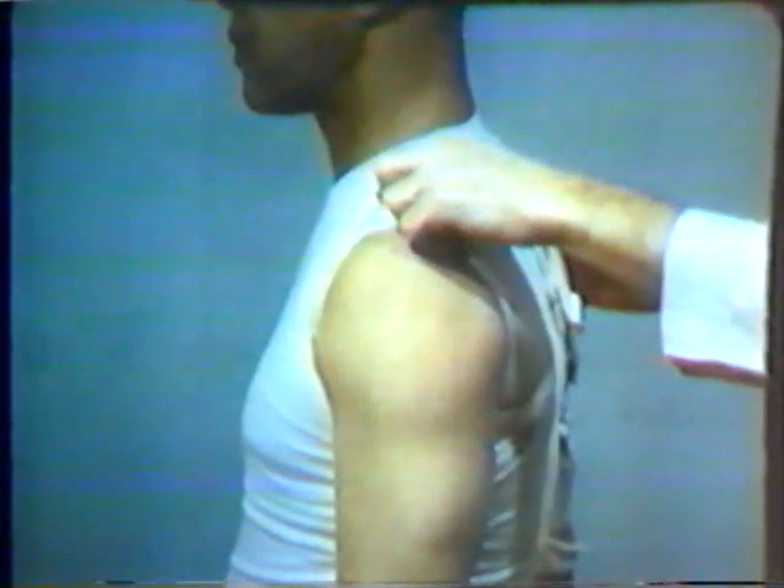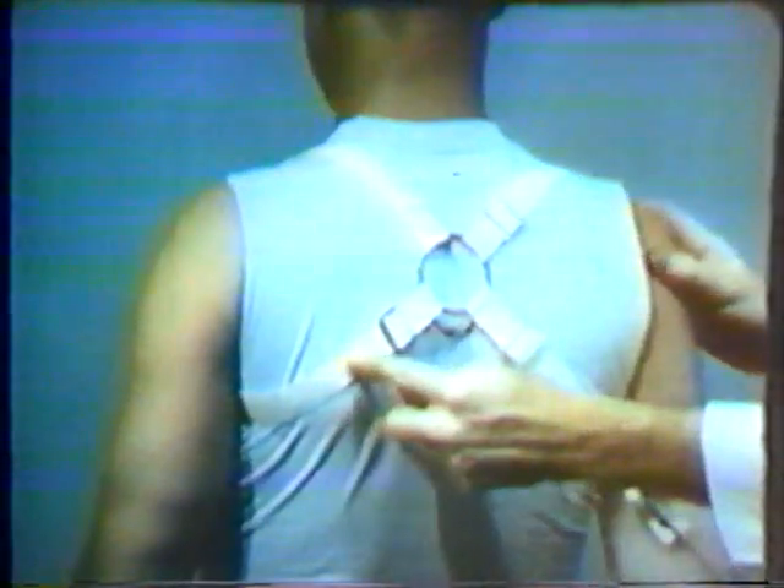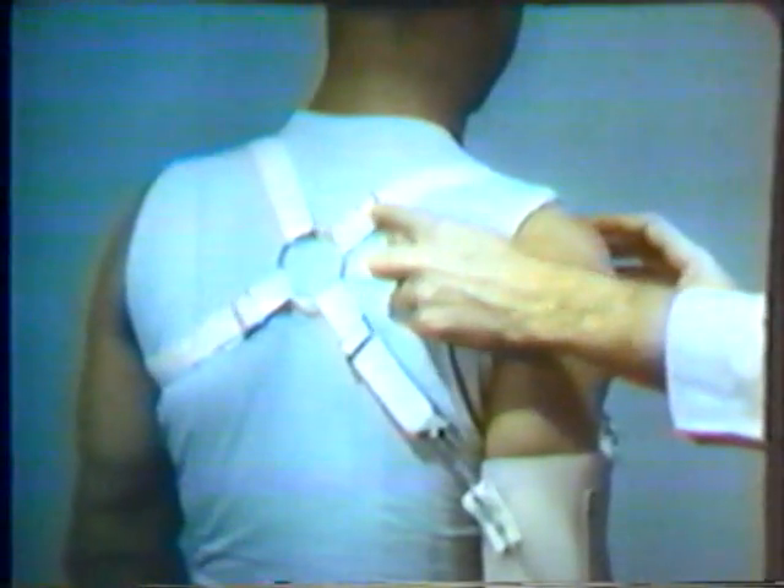Next, let's examine the below-elbow harness. The below-elbow harness serves two major functions: first, to provide for operation of the terminal device, and second, to retain the prosthesis securely on the stump. The harness is laid up in a figure-of-eight pattern. The crossing point of the figure-of-eight may be either sewn together or, as seen here, joined by a stainless steel ring.